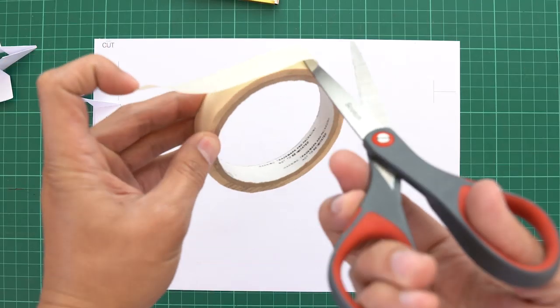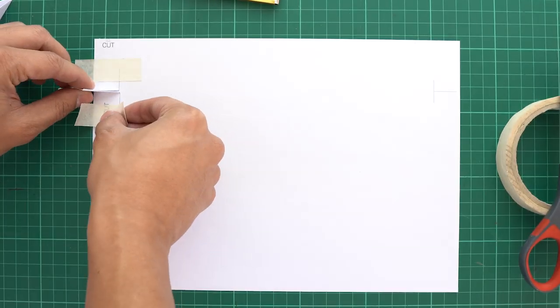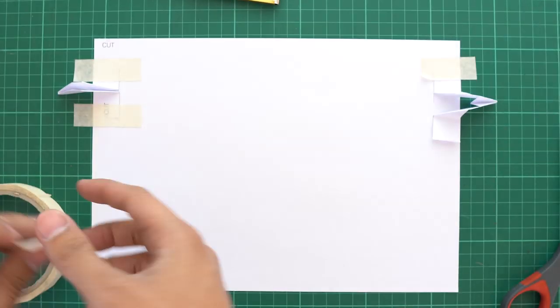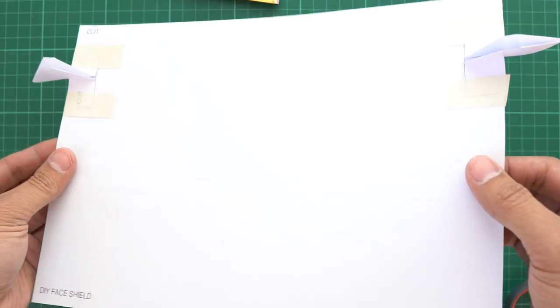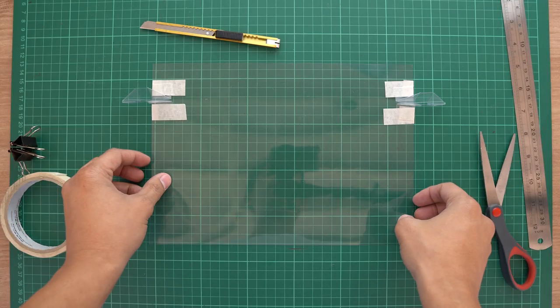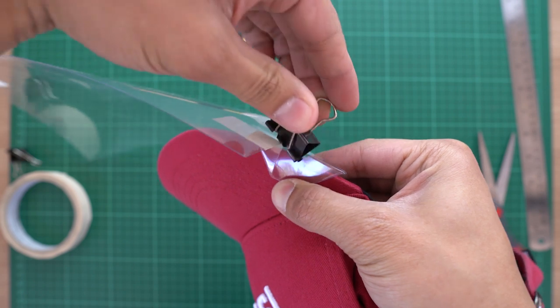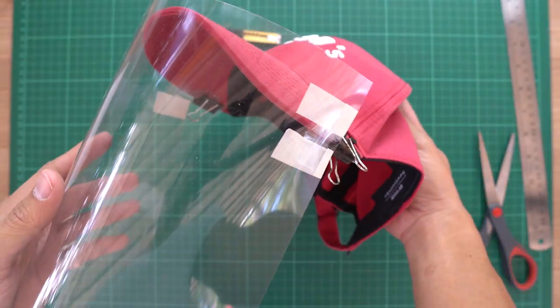You could also superglue these flaps onto the main PVC shield for a cleaner look, but I suggest using tape since it is more durable than superglue. And bam — you are now done with the hard part. Now all you have to do is clip these flappy parts onto the brim of your baseball cap. And you're done! Your very own face shield.